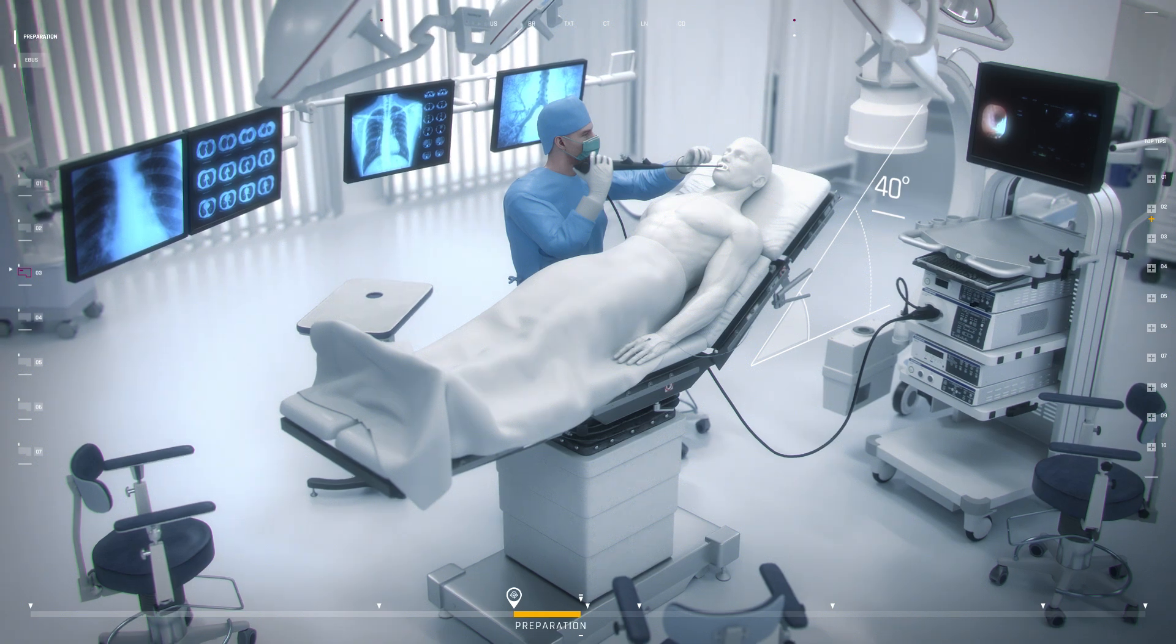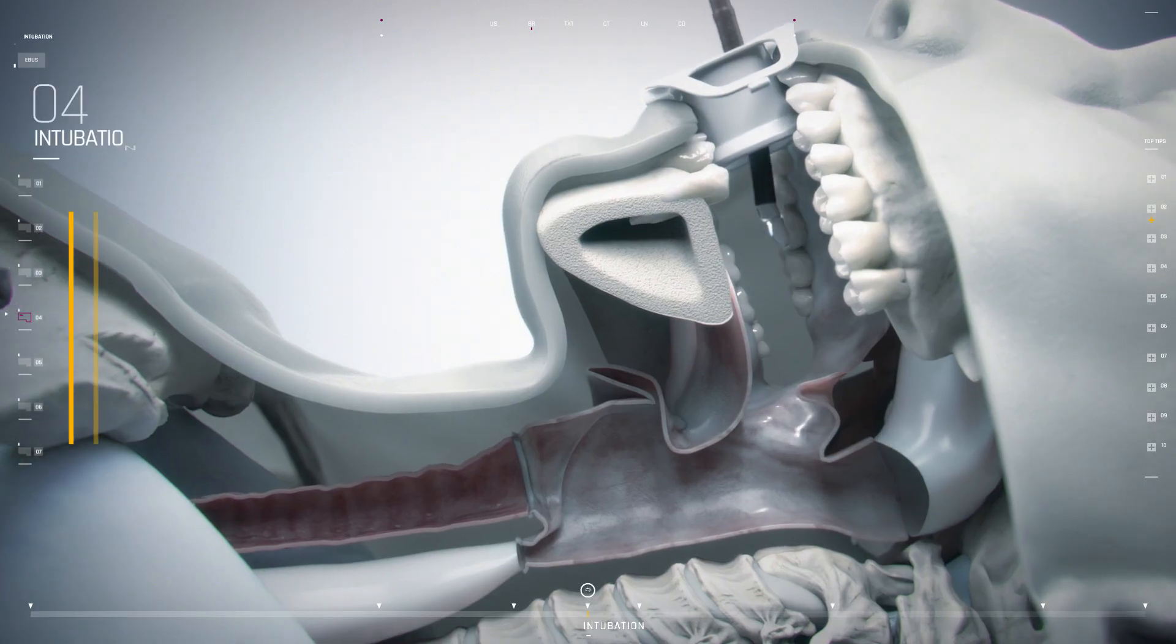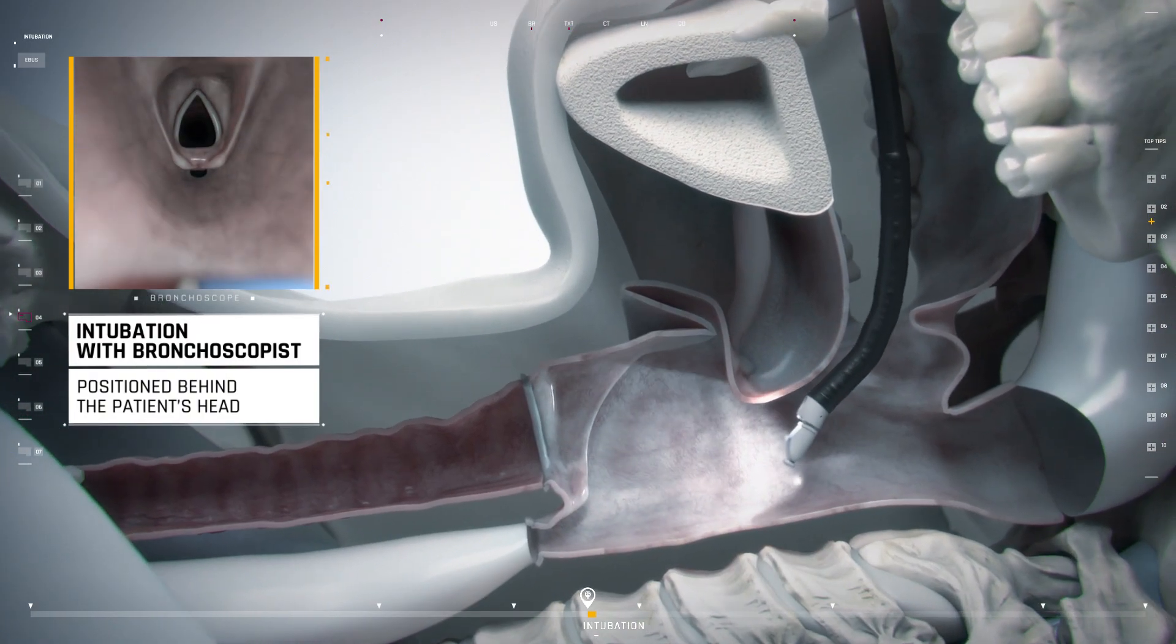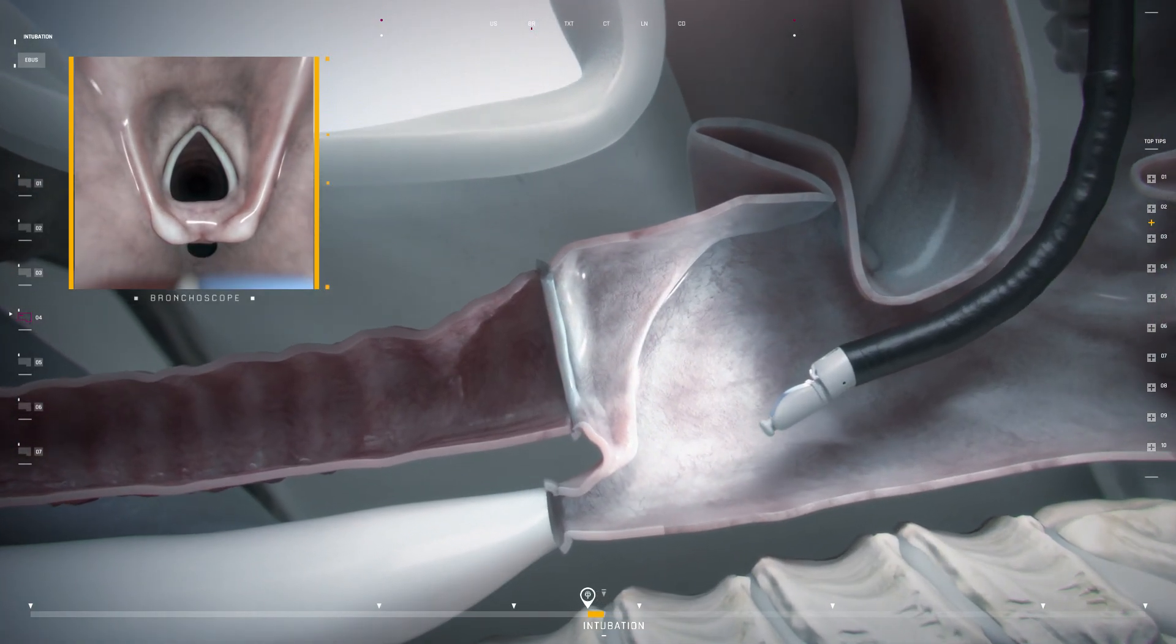The procedure can be performed facing the patient or standing behind the patient's head. Care is needed when intubating the trachea. Often only the anterior apex of the vocal cords is visible as the scope enters the subglottic space.